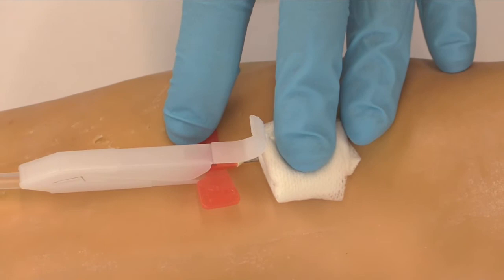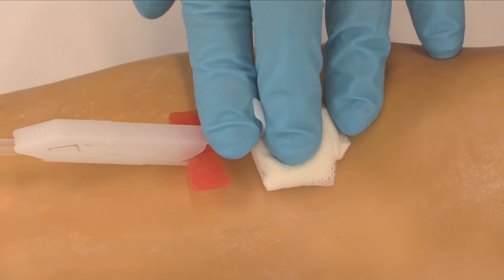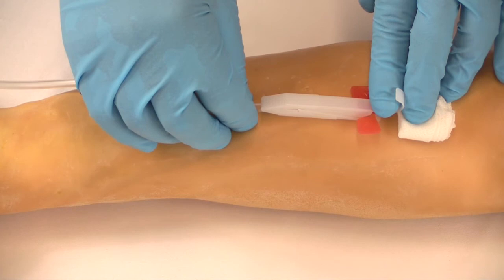Move MasterGard forward until the lower jaw is under the wings. It is very important that the guard does not touch the venipuncture site. Place your index finger inside the finger shield and gently place your middle finger on the dressing over the venipuncture site.